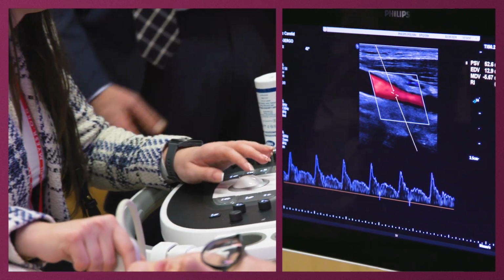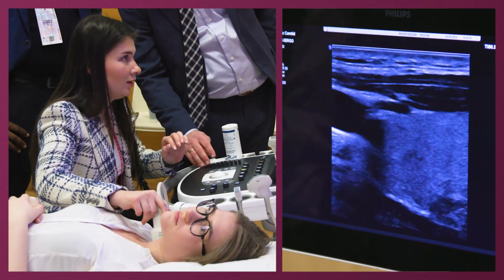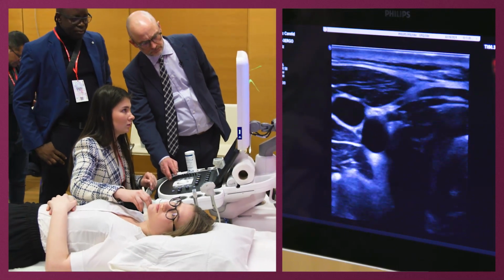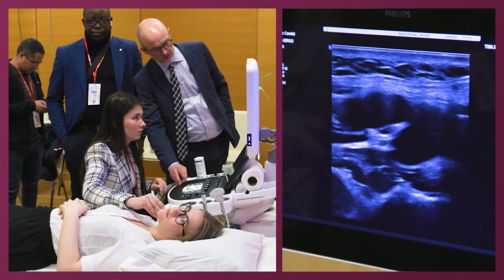Very good. I'll help you. Okay. So that was the common. Yes. And now you found the bifurcation. Yes. You are fast.